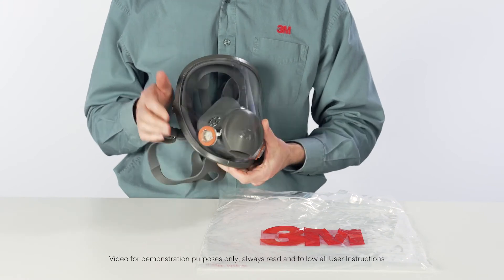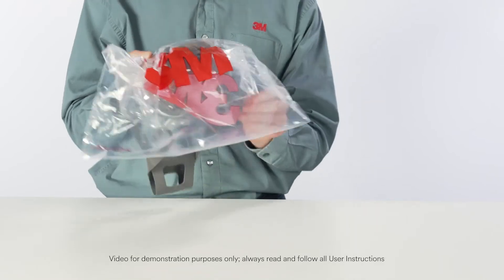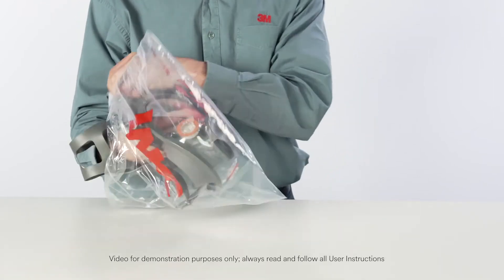When not in use, store your respirator in its resealable storage bag or other suitable storage container, away from contaminated areas.